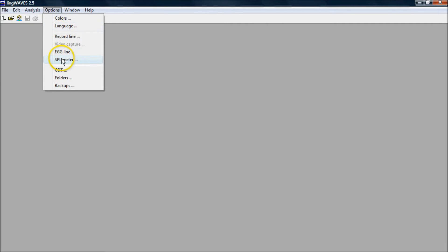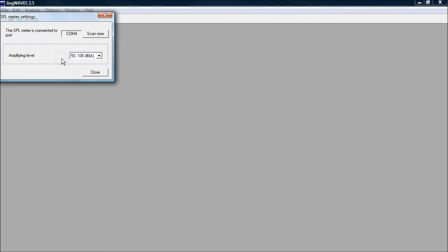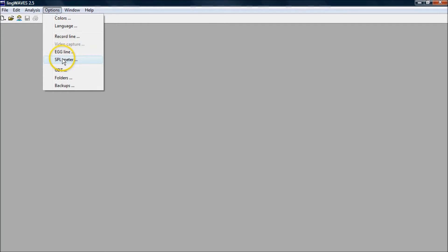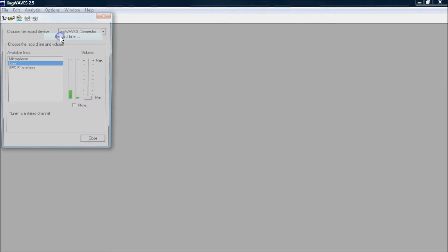Always turn on and plug in your microphone before you start LingWaves, and then check your microphone settings in Options. Go to SPL meter and make sure it's connected to a COM port. If not, you scan. Now check the recording levels — go to Options and Record Line.